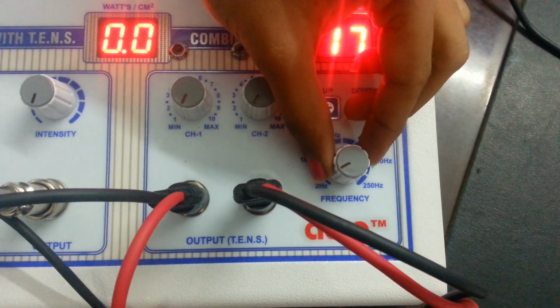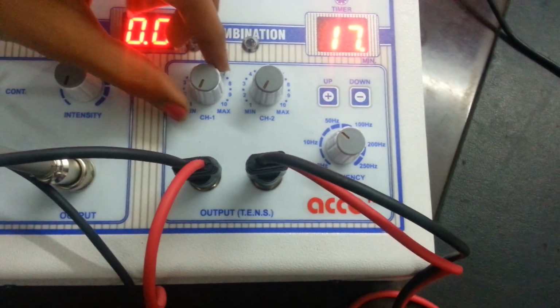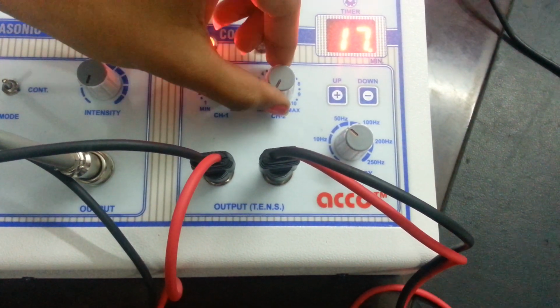Now set the frequency as per your requirement. Now increase the intensity as per your need. Intensity channel 1, intensity channel 2.